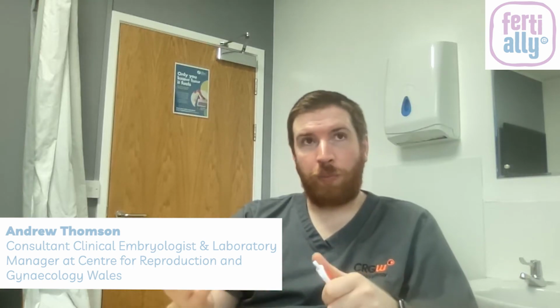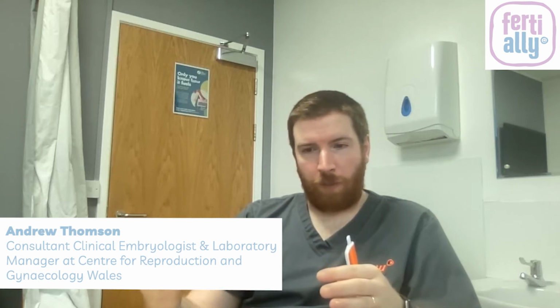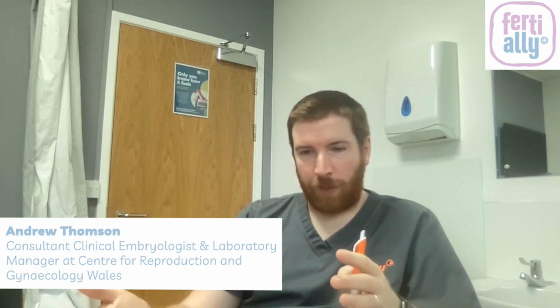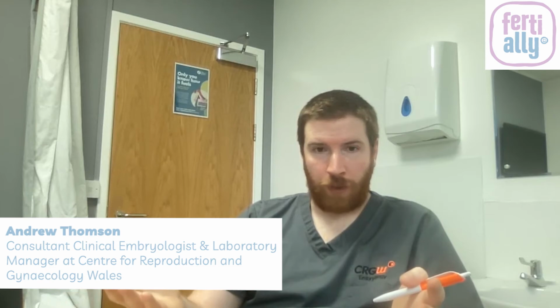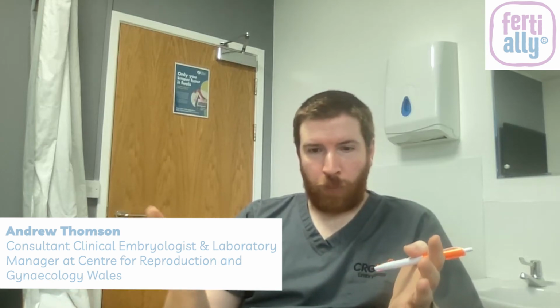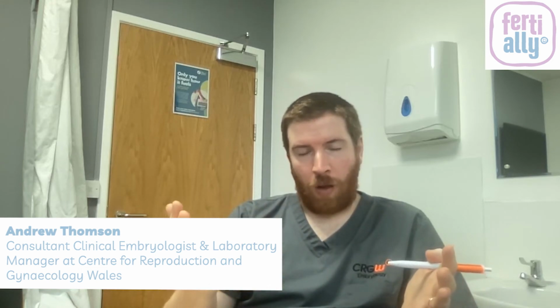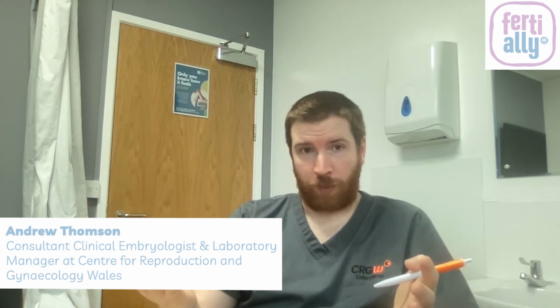Now, when you compare the outcomes, if you look at clinical pregnancy rate per transfer, whether it's a time-lapse embryo or a conventional incubator embryo, the pregnancy rates are identical. But what the laboratory key performance indicators have shown is that in the time-lapse incubator, you get a lot more blastocysts formed, a significantly improved blastocyst formation rate.